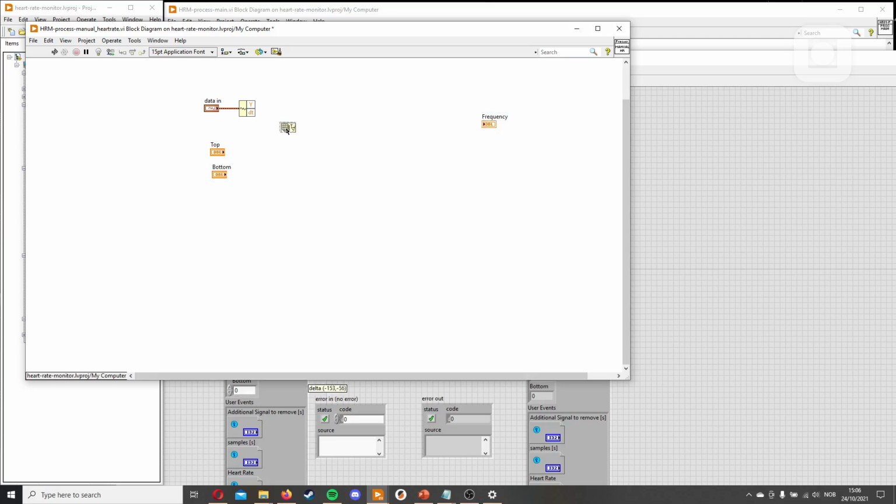But the question is how? What we need is some sort of mechanism which counts how many times the top crosses after the bottom has been reached. We can't just have one value because maybe it goes over it, goes under the top value again, and goes over it again, but this is just a ripple around our top value and does not indicate another heartbeat. So what we need is a bottom value, which kind of says if it's below this value, you can register top values again.